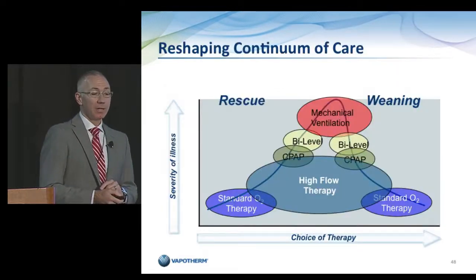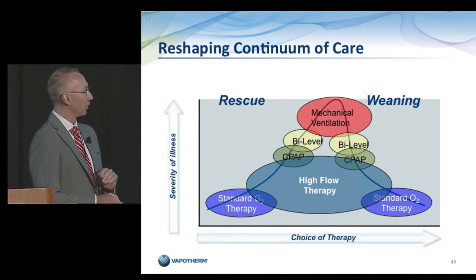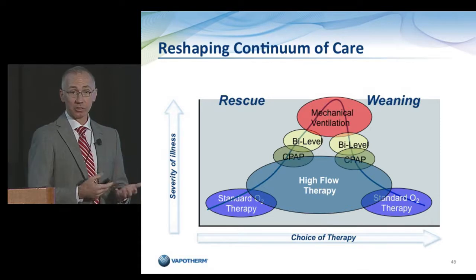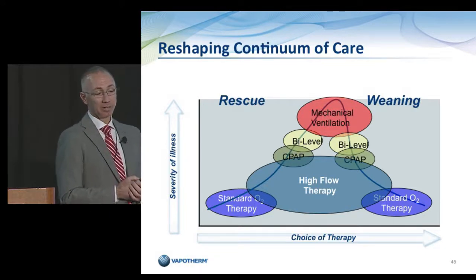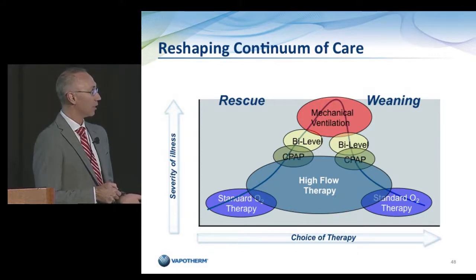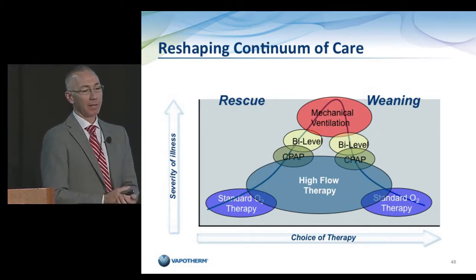But if we think of RSV or severe RSV bronchiolitis in the ICU as a disease that runs a course of a crescendo, a peak, and a decrescendo, the beginning of that syndrome can be managed by standard oxygen. And up to not too long ago, those patients that failed to maintain proper oxygen saturation or are just too tired or leading to respiratory failure would be placed on CPAP or bilevel non-invasive ventilation, and a sizable percentage of them will progress to respiratory failure and require mechanical ventilation. As they improve, some units extubate patients to non-invasive ventilation. Our practice is to extubate patients to nasal cannula.